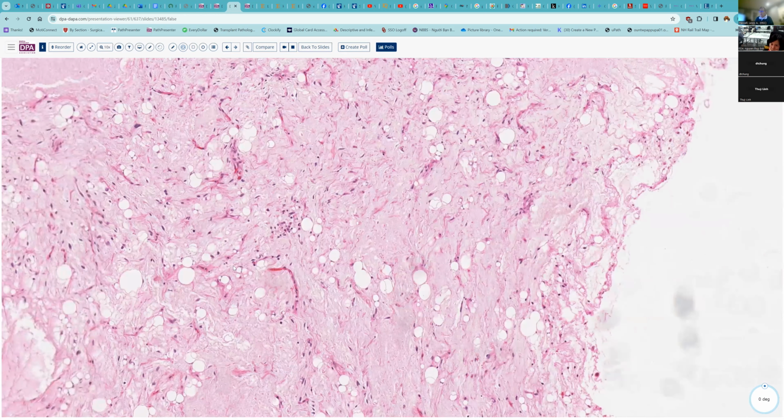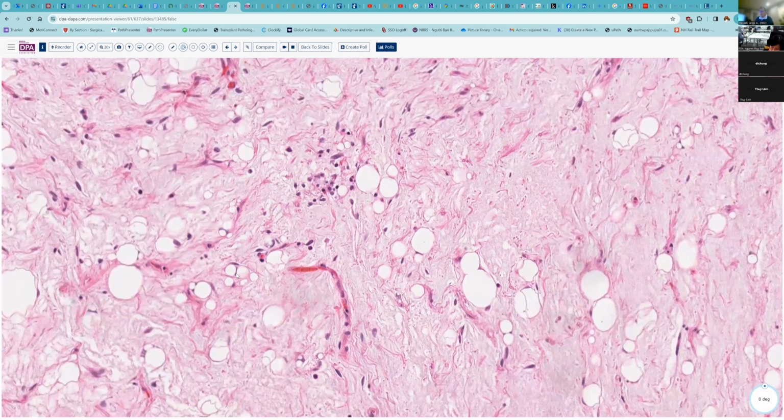So here we see this dual vacuole and a nucleus that's indented in between the two lipid droplets. That would classify. Here's another one. You can see here's the nucleus on both sides of this lipid bubble. So that fits nicely with this appearance.